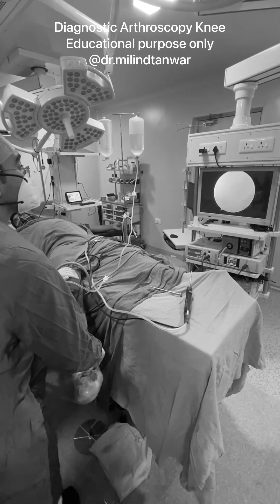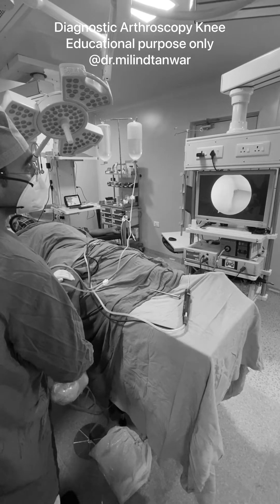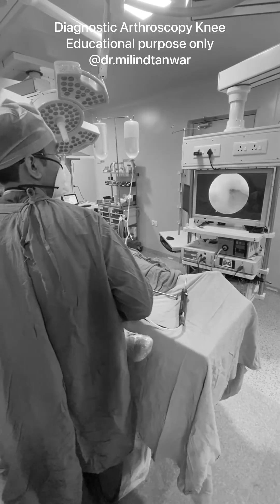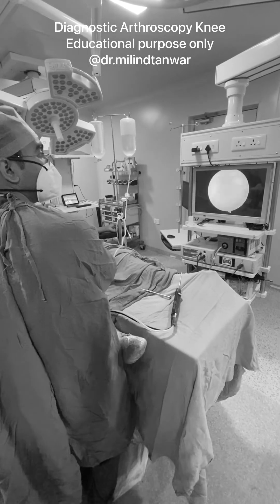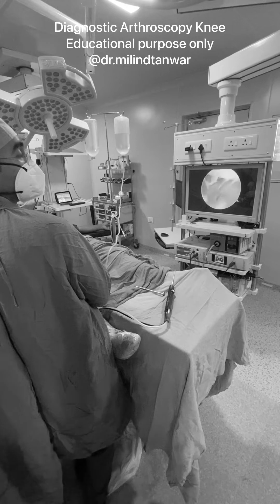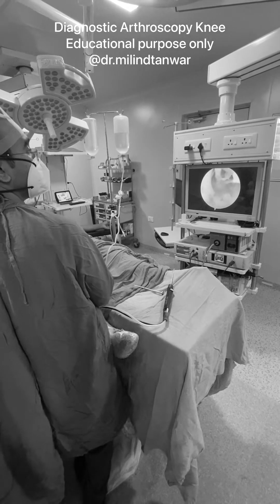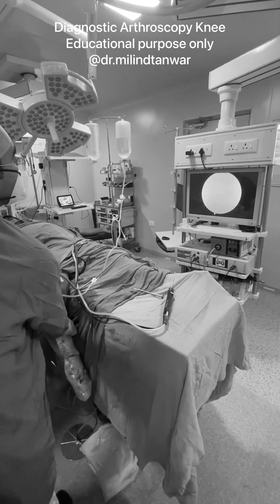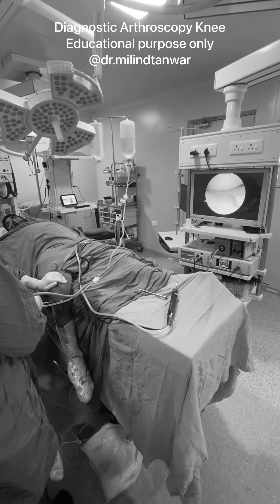For the medial meniscus, put the leg into a slight valgus strain and go into the interval between the cartilage and the meniscus. Hold this on the table and gradually go into the space — do not push the scope forcefully. Rotate your light source and you can see the root lesions, which are the meniscus root lesions of the medial side. You may cause some scuffing if you push the scope in and the joint is tight. We are now between the PCL and the medial side, and we have seen the root with minimal scuffing.